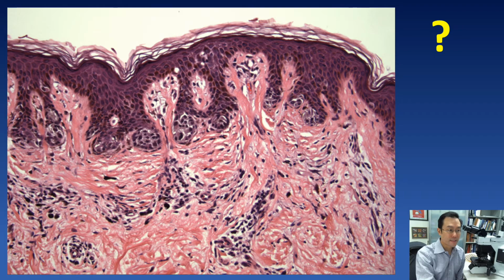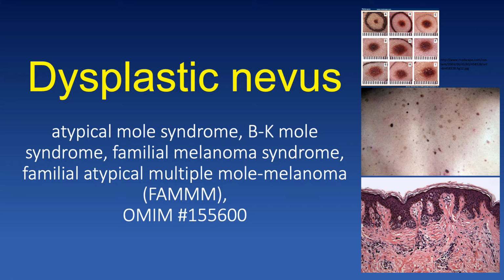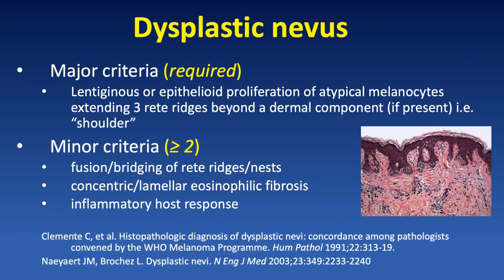Your diagnosis? I think this is a classic, by the way. Dysplastic nevus. One of the more significant, controversial, and challenging topics in dermatopathology.